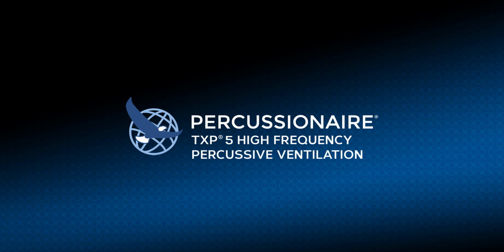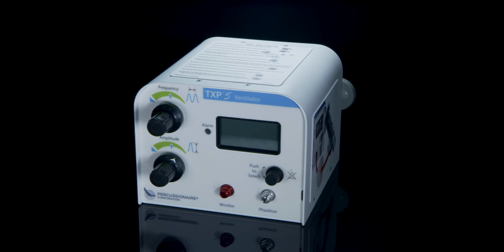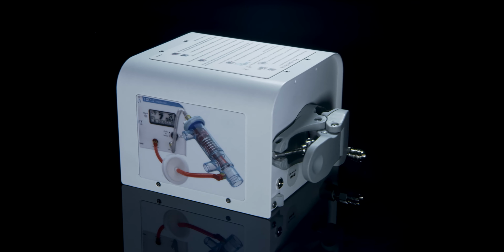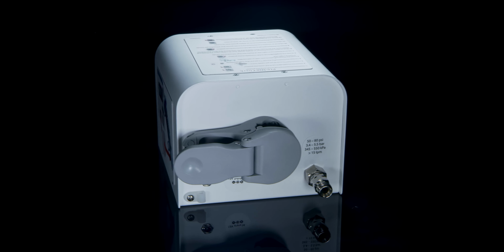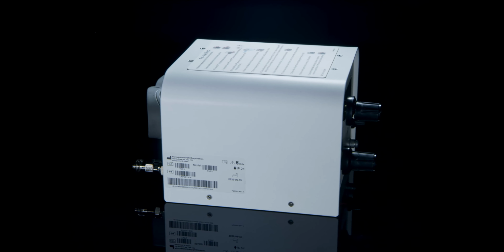Percussionaire TXP5 High-Frequency Percussive Ventilator. Theory and principles. The TXP5 is identified as a high-frequency percussive ventilator. It is not an oscillator, nor a jet ventilator. Its principles of ventilation lie in the widely used VDR4 and TXP transport ventilators.